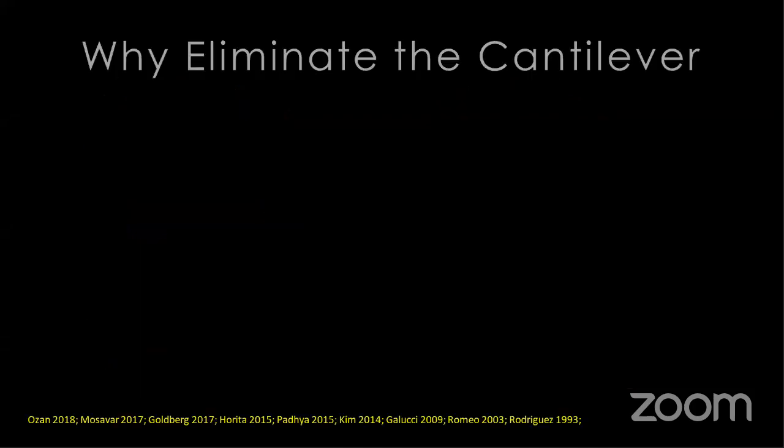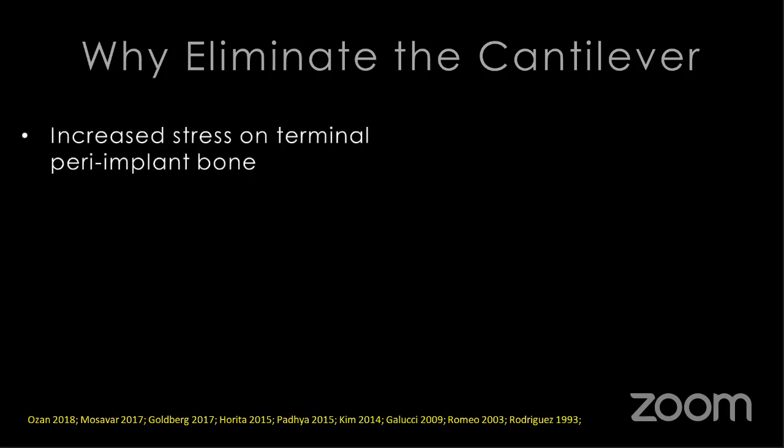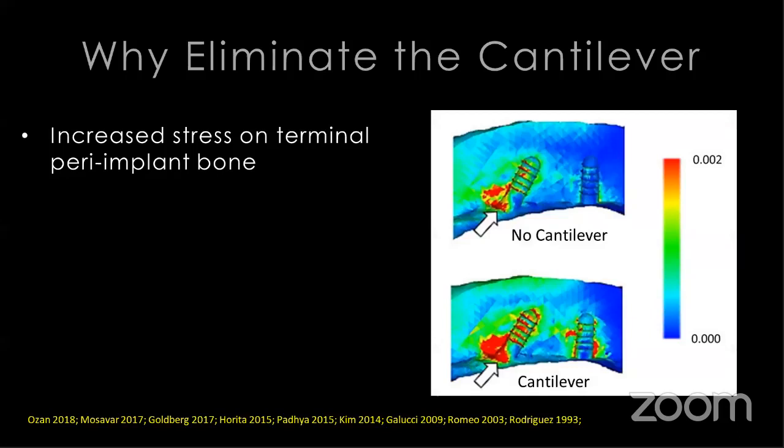So the other thing that a pterygoid implant can help prosthetically is eliminating the cantilever. And so why do we want to eliminate a cantilever? What's the problem with it? Well, we know there are multiple studies. I have a few listed on the bottom, but there are many more. And we know that cantilevers cause increased stress on the terminal peri-implant bone. It's acting as a lever. It's causing problems. Every time you chew on it, it's creating stress around that implant.